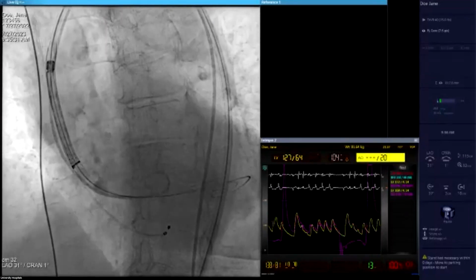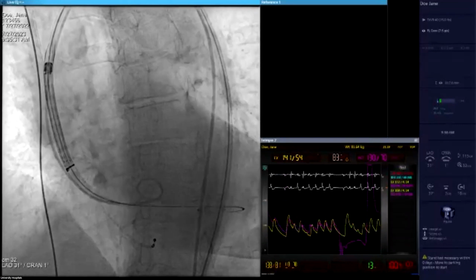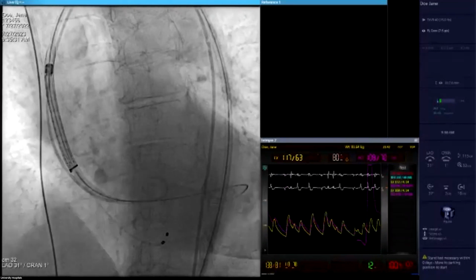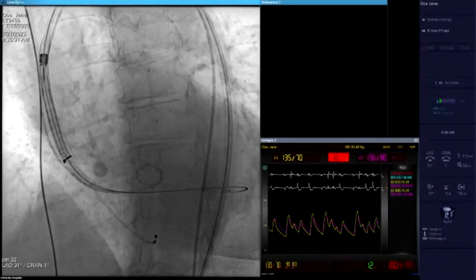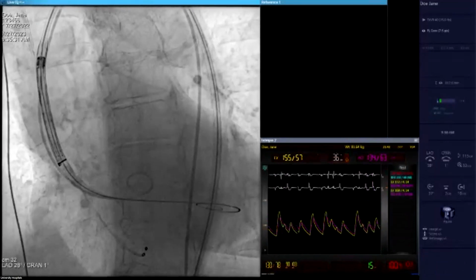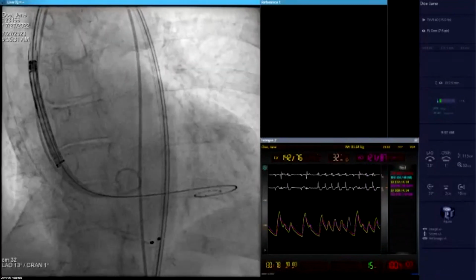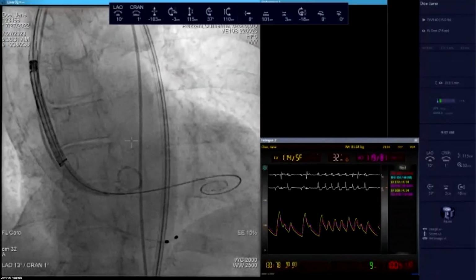All right. So as you can see, very horizontal aorta. You notice that we didn't take any pictures so far, just a puff, but no pictures whatsoever. Now I'm gonna go to a near cusp overlap view. I need a little more lights in the room, please. So it's gonna be LAO 10, caudal 37. It's LAO 10, right? I mean caudal 37. Yeah.